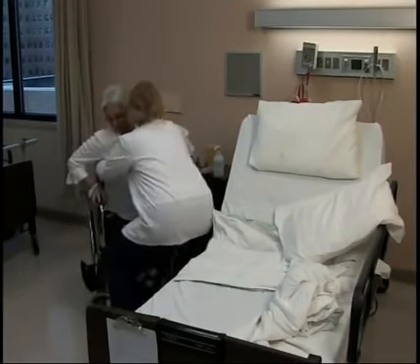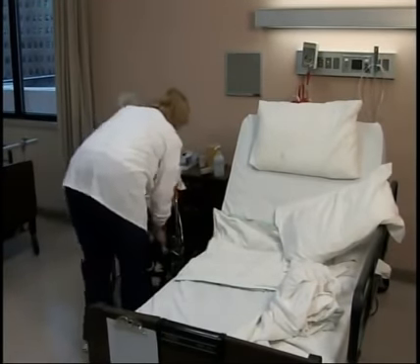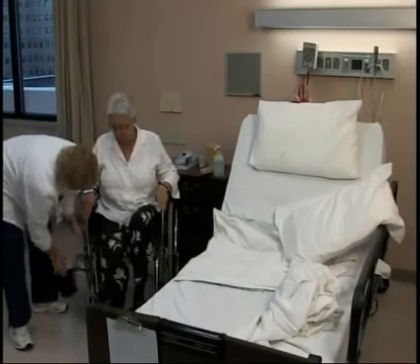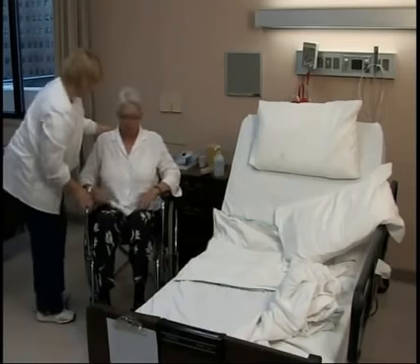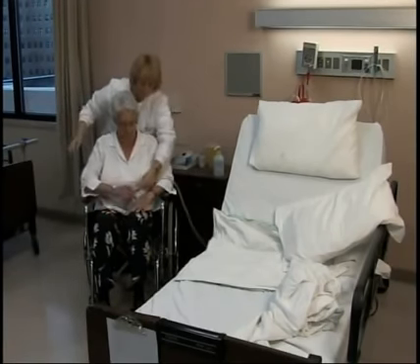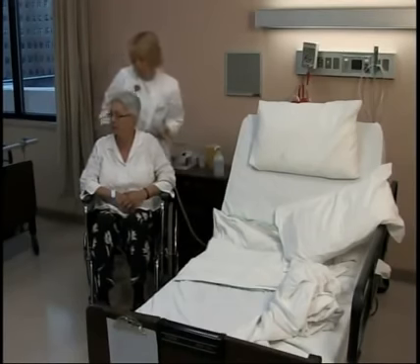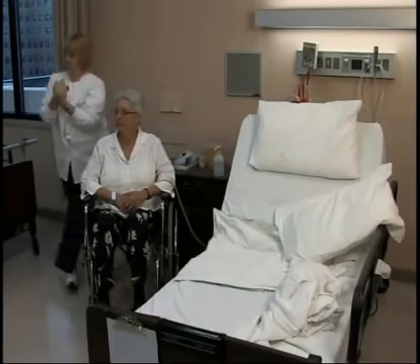Adjust the patient in the chair for functional body alignment. Place the footrests on the wheelchair if necessary, or push them back into position. Support a weaker arm on a pillow if necessary. Always face the patient toward the front of the room, toward activity, and make sure the call bell is in reach. Lock the wheelchair. Let the patient know that someone will be down to take them where they are going. Wash or squirt your hands with gel and document.